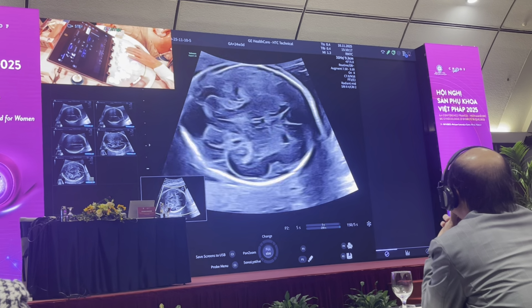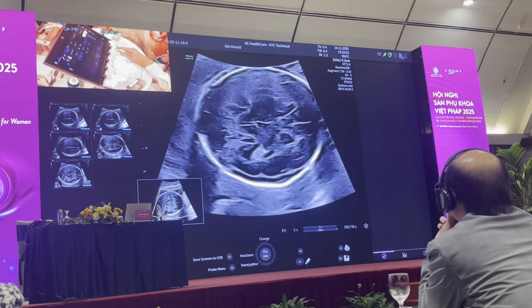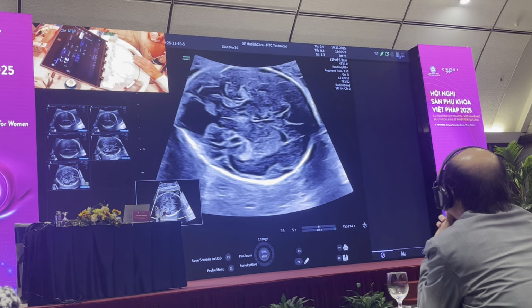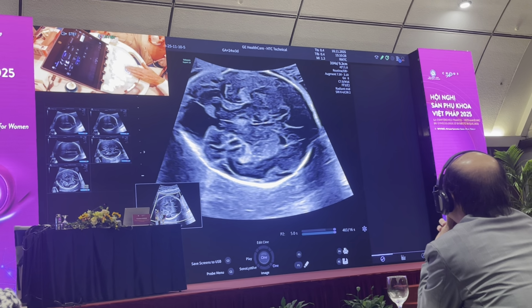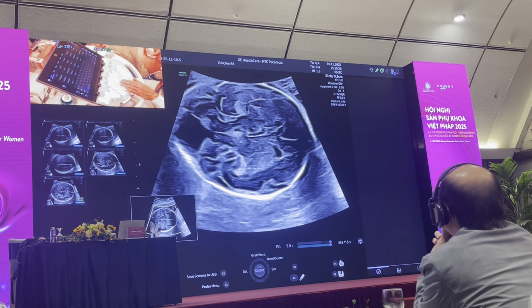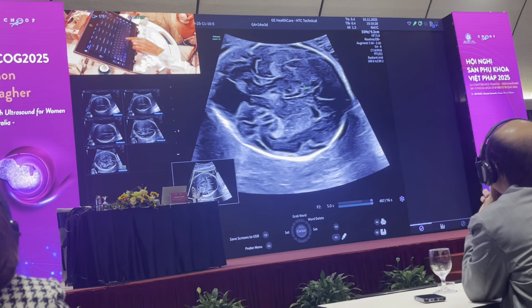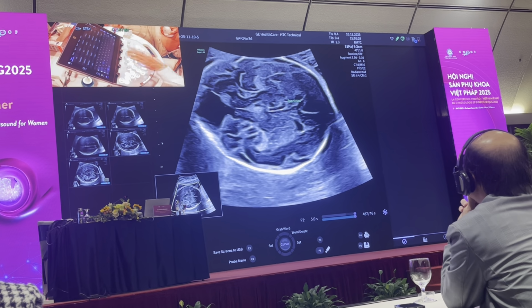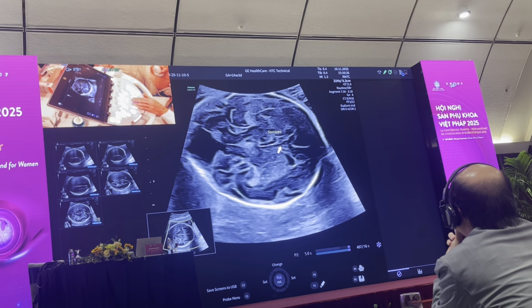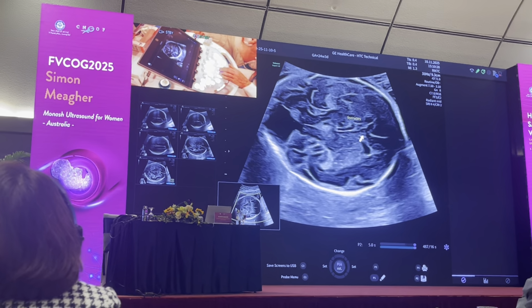And I clear the text, and I go to the final section of examining the brain, and this is to look at the cerebellum. As I come down to the cerebellum, again try to bring the cavum septum pellucidum into view. And again, I can see the fluid just here is the cavum septum. This structure on either side is the fornix. This is the fornix on the near side, just here. And this is the fornix on the far side here. And between here is your cavum septum.